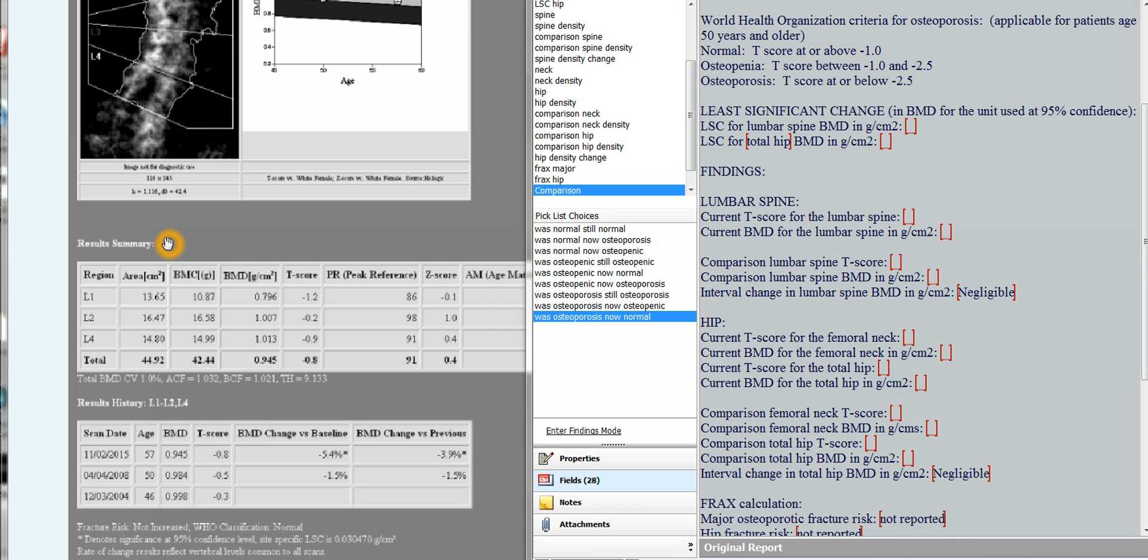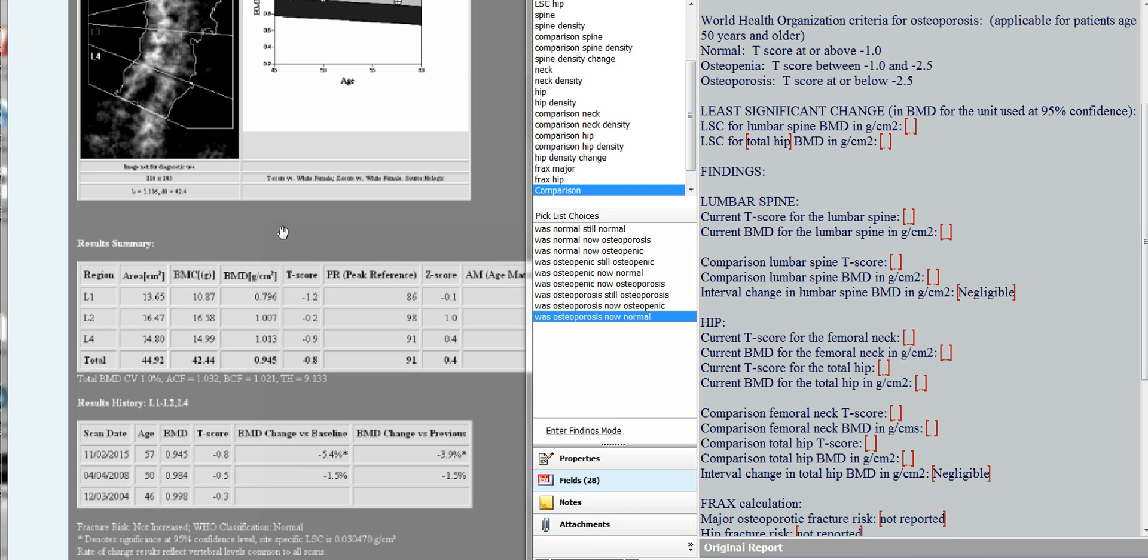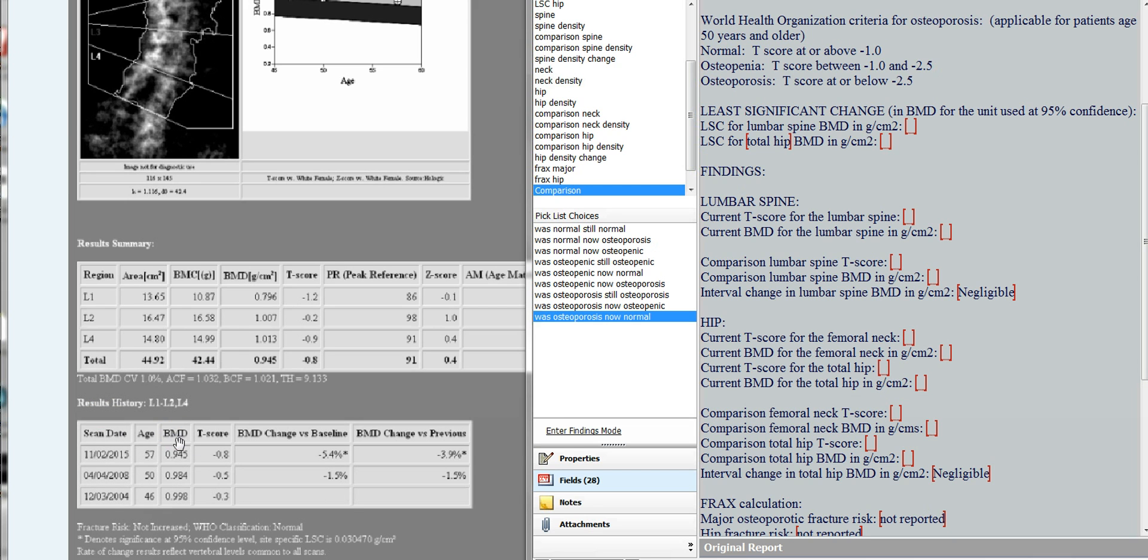The first thing to compare, you have to make sure you measure the same levels in the same way. In this particular case, they measured L1, L2, and L4. They left off some of the sclerosis at L3. Even so, I probably wouldn't believe the results. They seem quite sclerotic at the other levels, but in terms of how to calculate the statistically significant change, what you do is you look at the total bone mineral density here. And then this table, the results history gives you the total bone mineral density for the spine for the current exam and for the comparison exam.